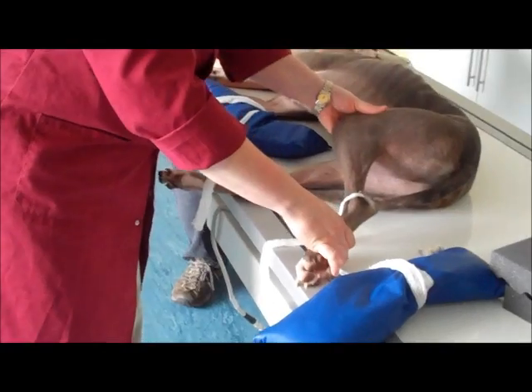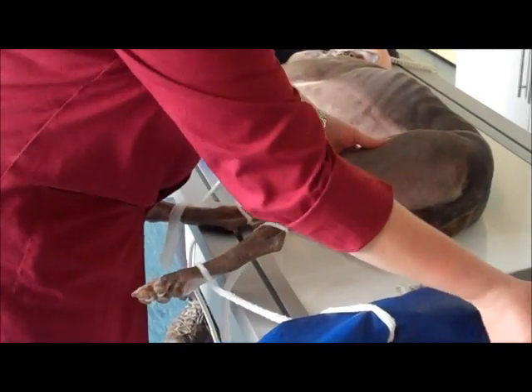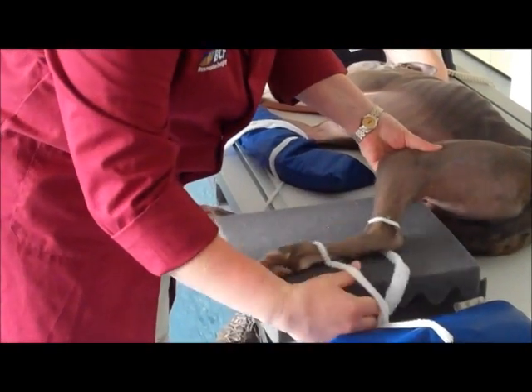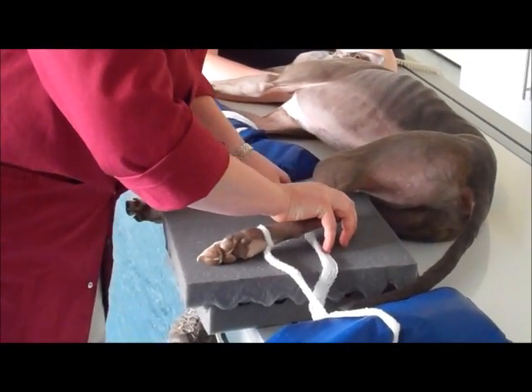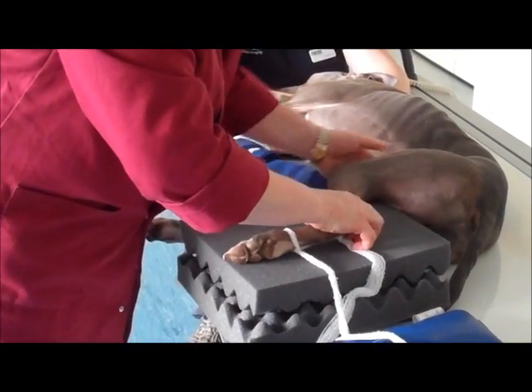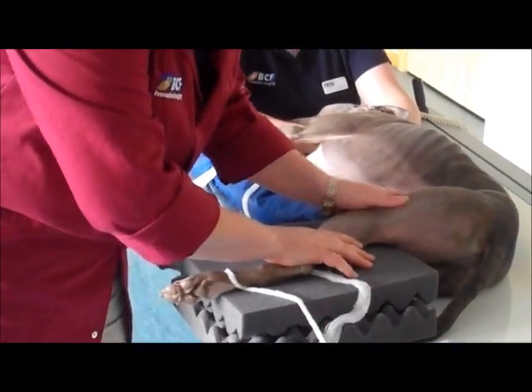We also need to position the femurs separated from each other, so we'll do that with a bit of foam. If you place this underneath the stifle region, that will give enough support to the limb.